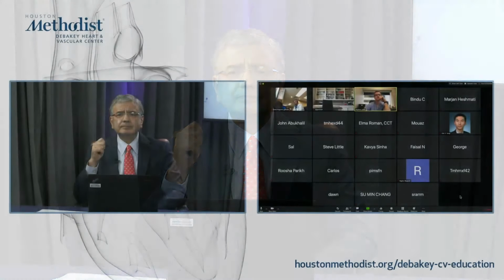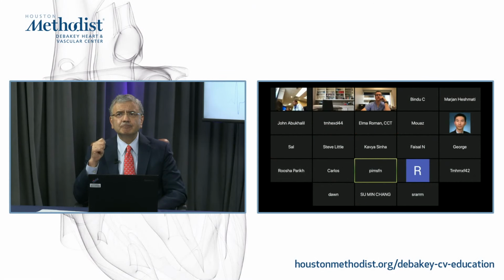Very good. Other questions? Dr. Zoghbi, this is Raghu Mupiri from Baytown. In terms of day-to-day use, contraindications-wise, if there are any shunts, especially a large right-to-left shunt, I mean, that's contraindicated. But what about a small PFO or a small bidirectional PFO? Would you still use it?